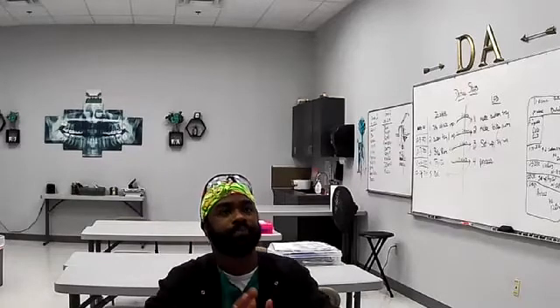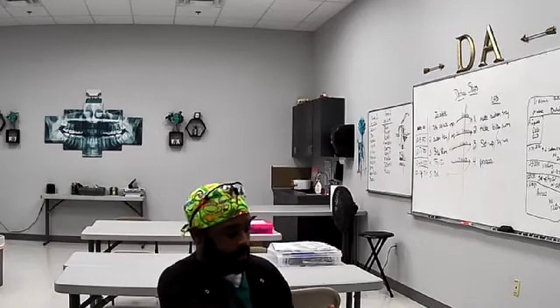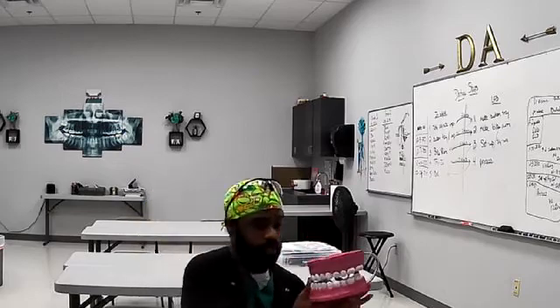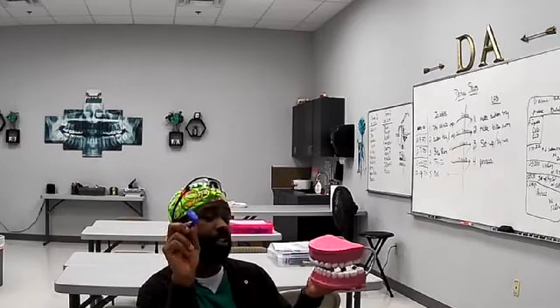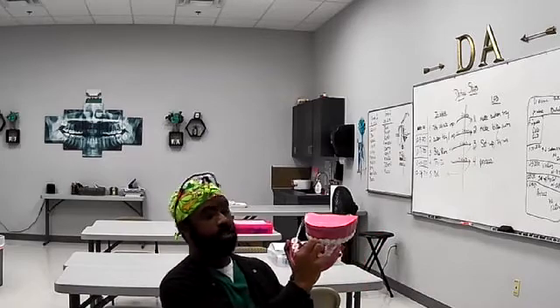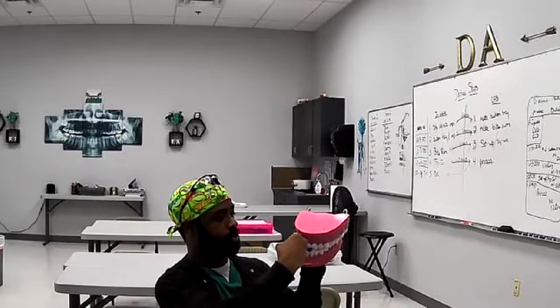Let's skip down to periapical, or PA. A periapical X-ray, or PA, is one that captures the whole tooth. So if I say the patient is hurting on tooth number 8, then you would know to get your anterior, which is blue, anterior periapical, or anterior PA, that would go right behind tooth number 8. That's the only tooth you worry about. Okay. And you bite, you line it up, shoot, just like we did.